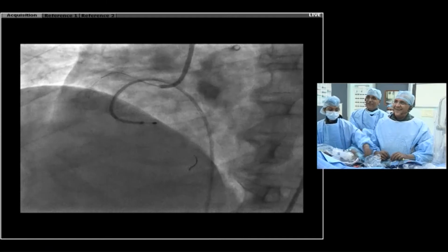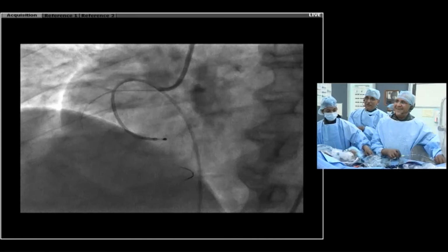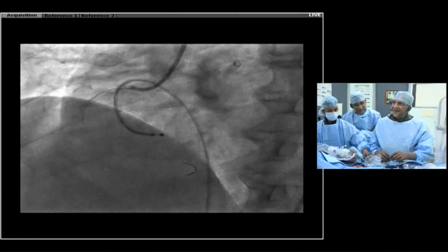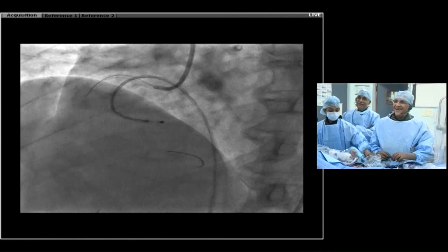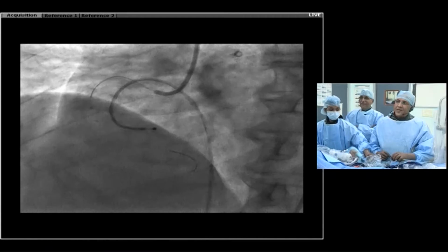But Kirti, recently we used it in one of the patients. I felt it is slightly better, more comfortable, but if they make it too expensive, I don't think it is that worth the cost. They actually had to modify it. Then it doesn't remain so comfortable, does it? They had to modify it because it was a pain to remember when you're using an IVUS catheter.